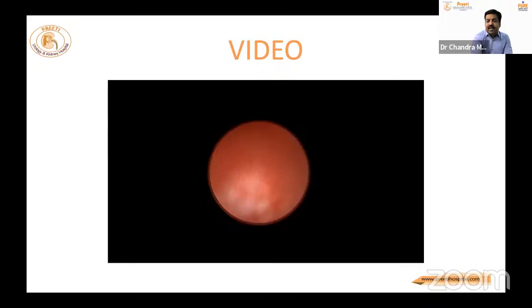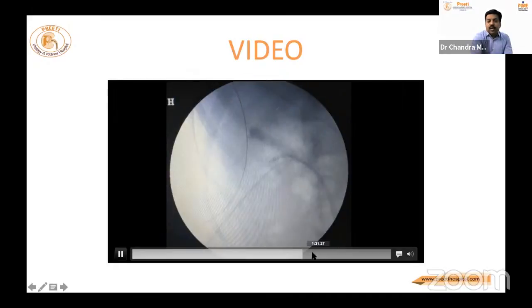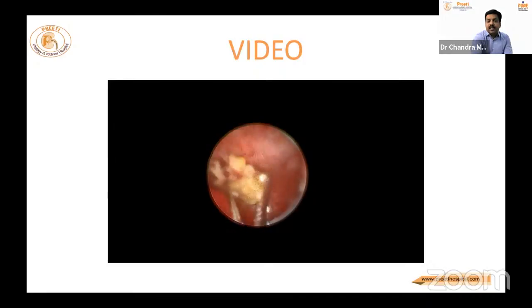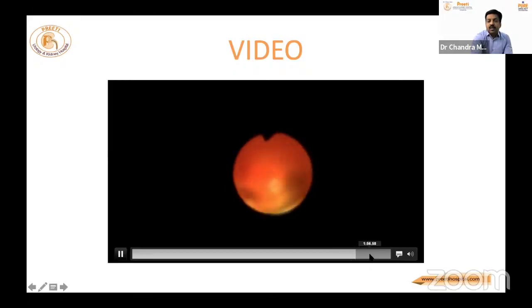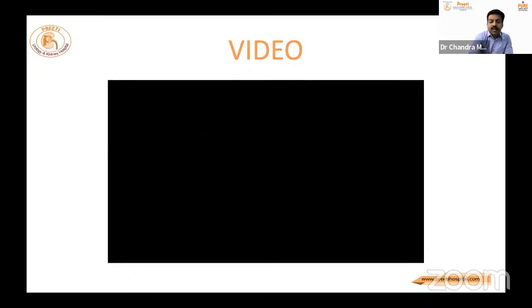See, this is the angle Dr. Kwon was mentioning. If you tilt the thigh and the buttocks a little more medially, it will be useful. See, I'm not entering anywhere now. Now I will go into the other calyces like this and bring it out with the basket, preferably this type of basket which can remove the stone easily. Now the flexible scope person is taking it out. So like this, we can show any number of cases. See, at the end, no injury to any of the calyces except the inferior calyx.